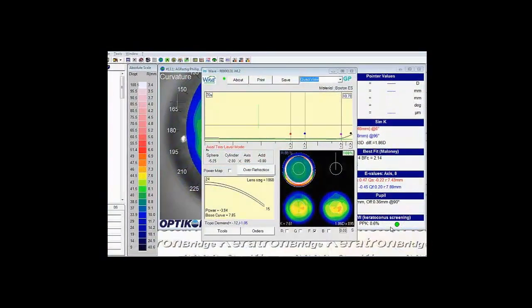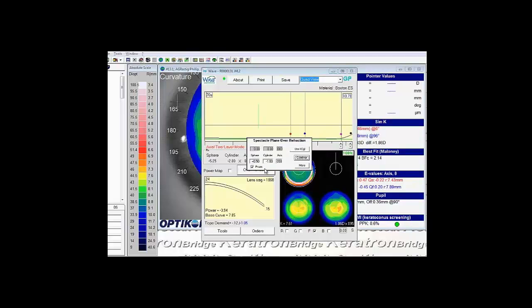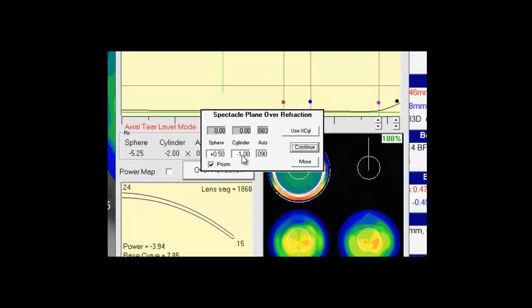And finally, when it comes to the over-refraction, there are cases where we'll have subsequent over-refractions, whether it be troubleshooting the lens itself or as the years go on, we just make small adjustments. So when we click over-refraction, if we already have a value in these white boxes, we do not overwrite those. If you overwrite them, they will delete the initial over-refraction and use your new one.